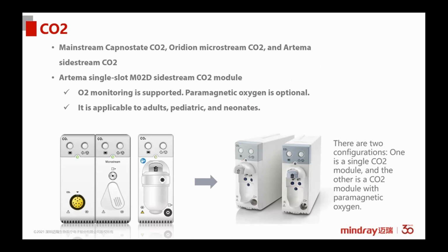non-intubate patients. And for the mainstream module, it's equipped with an external CO2 module, a CO2 sensor on the airway adapter directly. So it connected to the patient breathing system, and this one is only suitable for the intubate patient. And Mindray latest single slot, we called it M02D module, is used for the side stream CO2 module.